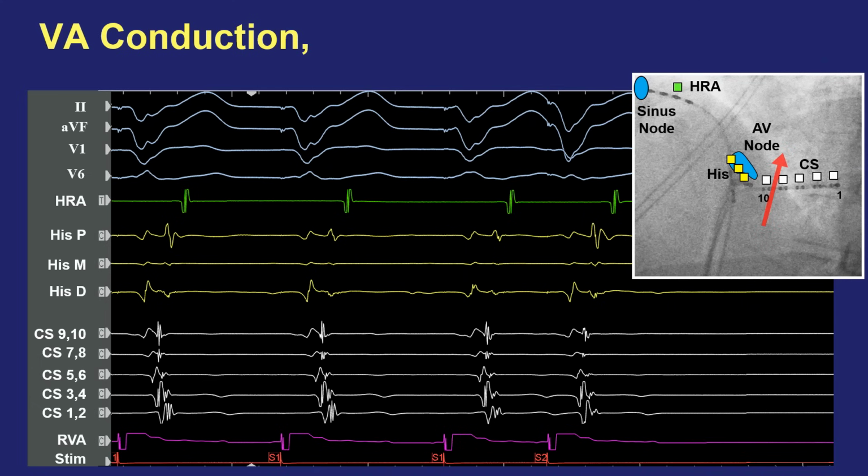It's just off the septum, but as I talked about atrial anatomy, some people do have a leftward extension of the AV node, and it also depends on exactly where the coronary sinus catheter is positioned. If CS910 is right at the septum or hanging out in the right atrium a little bit, or pushed into the coronary sinus a little bit, I would still call this, even though the His catheter is a little bit late, a central or concentric activation of the atria, because it's certainly still possible that we're close to the septum, that this could be an AV node extension.